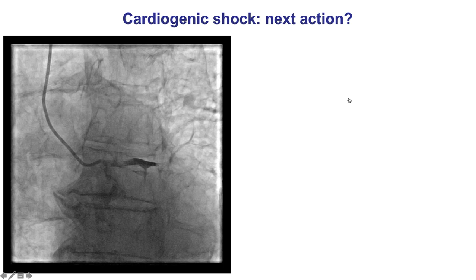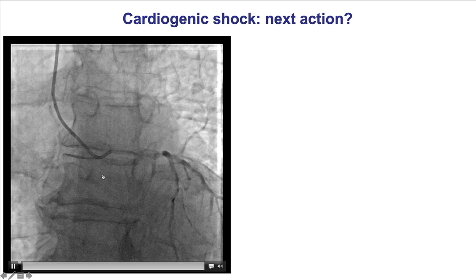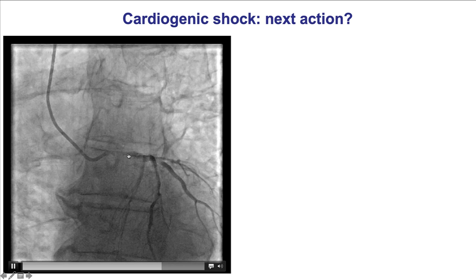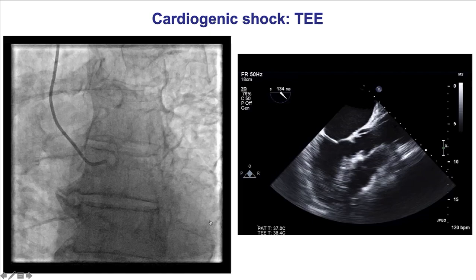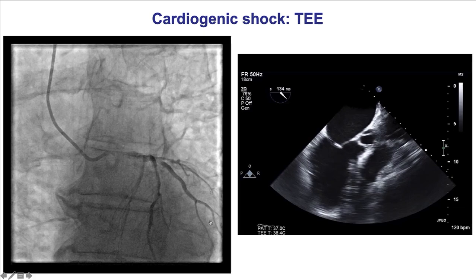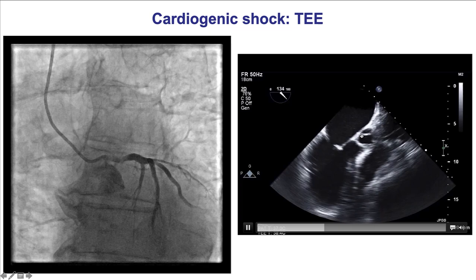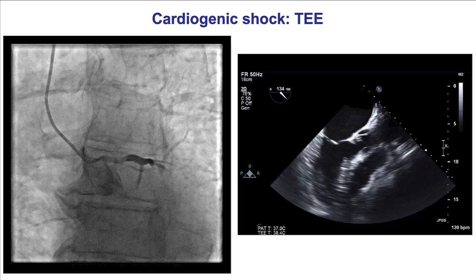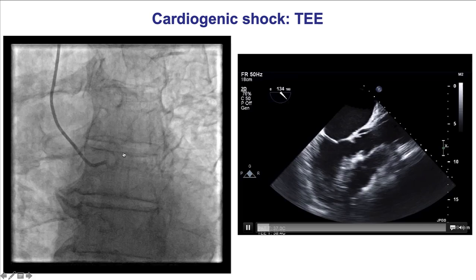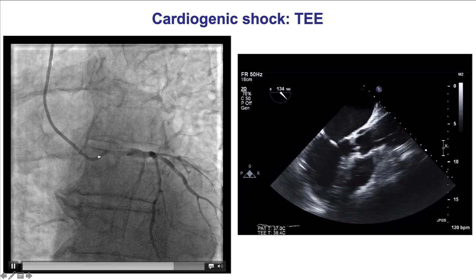A final case that is slightly different: this is a patient who presented in cardiogenic shock, and the first image of the left coronary system shows the left main looking hazy, although there is not much disease in the remaining vessels. This was actually an example of aortic dissection causing compromise of the left main and cardiogenic shock. Aortic dissection is one of the potential causes of acute vessel closure — not iatrogenic, but can happen spontaneously. It is critical to diagnose this early because the patients will need emergency aortic surgery.